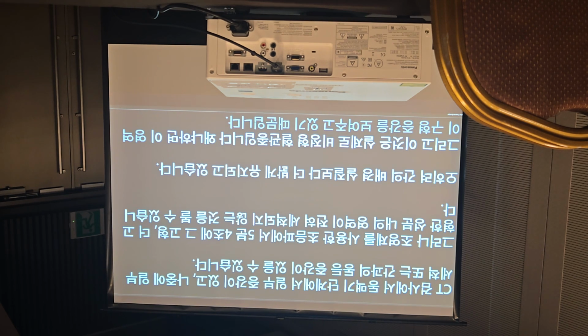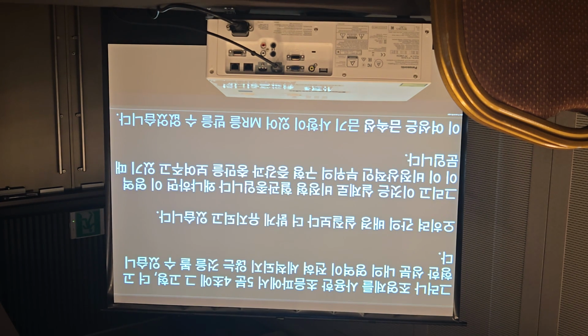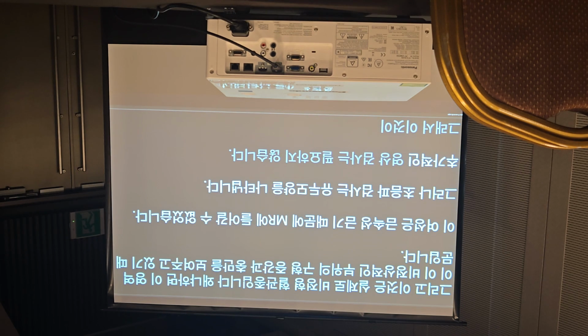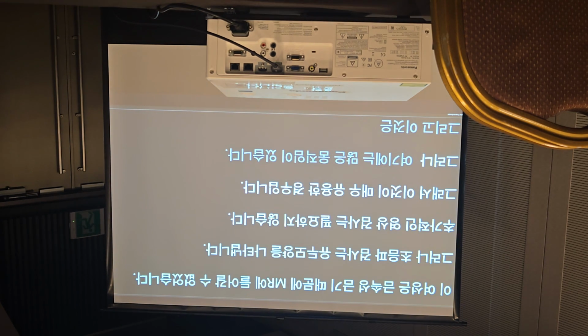This lady couldn't go into an MR because she had a metallic contraindication, but the ultrasound examination is pathognomonic. There's no further need for imaging, so this is where it's very useful. But notice there's a lot of movement here, and this may detract from the actual image itself.